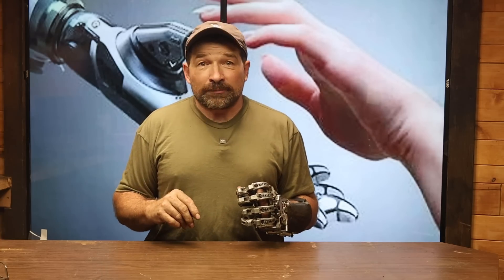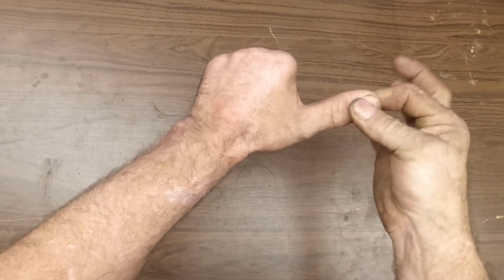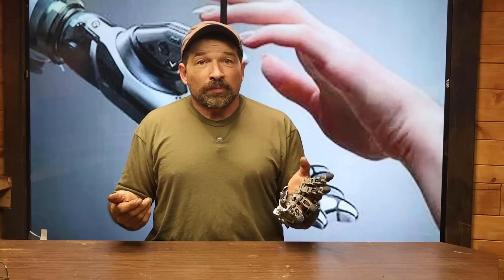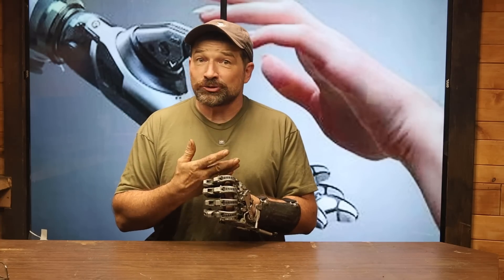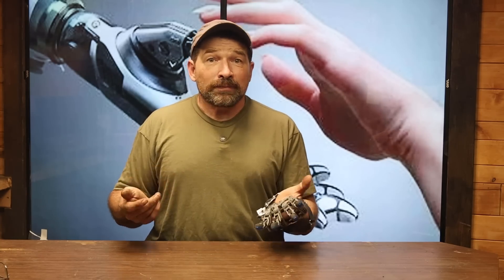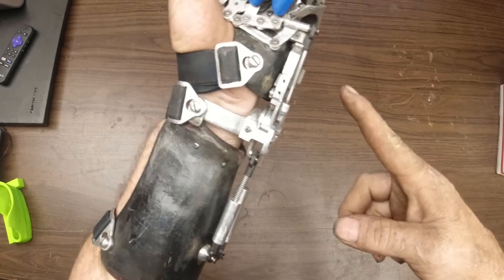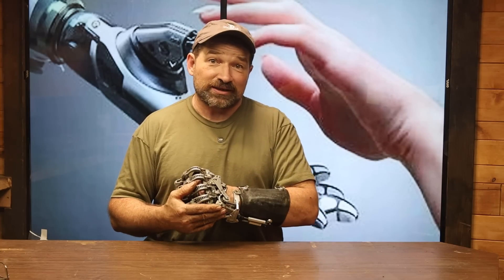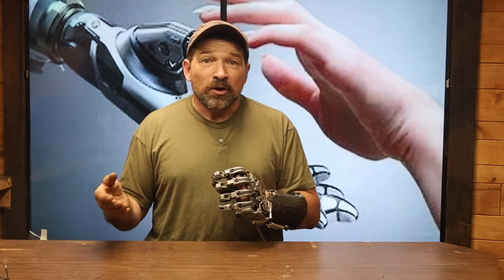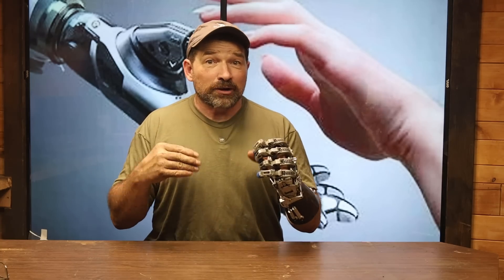For this one, I'm looking for amputees that have had their index through pinky fingers amputated through the metacarpal phalangeal joint and have retained the entirety of their thumb. It's also important that for at least this first batch, all of their metacarpals are still their full and natural length. The metacarpals being their natural length is important because that sets up the geometry for the device, primarily the closing angles for the fingers relative to the thumb, as well as the position of the other major component groups. Basically, I need as much real estate for everything to fit as I can on these first few kits. I might be able to be less rigid with this requirement in the future, but for right now, full-length metacarpals only.